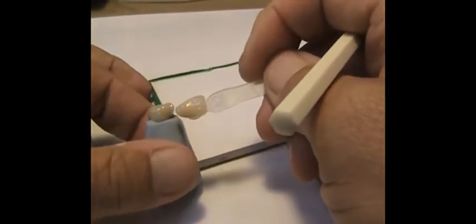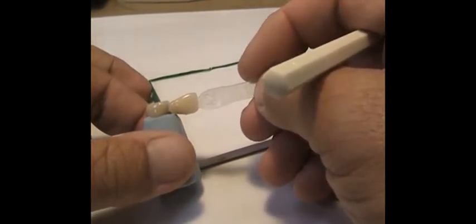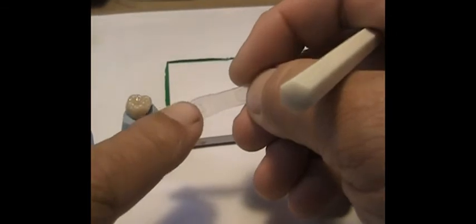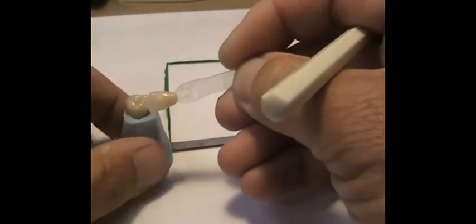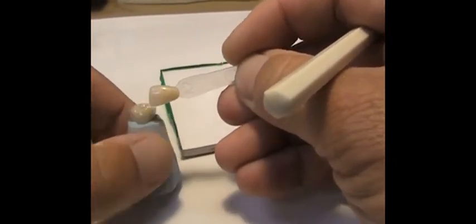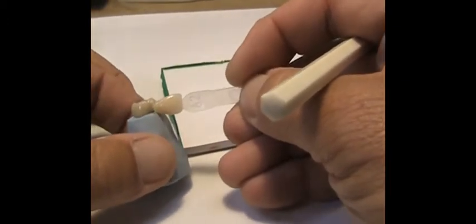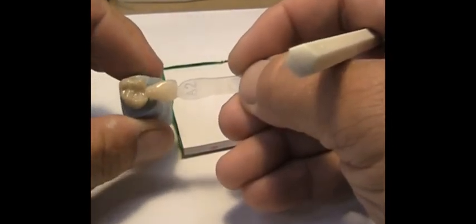It looks like it's right on the money. On these shade tabs, the darkness you're trying to match is the darkness on the neck of the shade tab, because as you move down there's translucence. I see so many people put the shade tab incisal up against the unit they're trying to match, instead of the neck where most of the color really is. By holding the neck up to the unit, we have a much better judgment on shade — and we're right on the money.